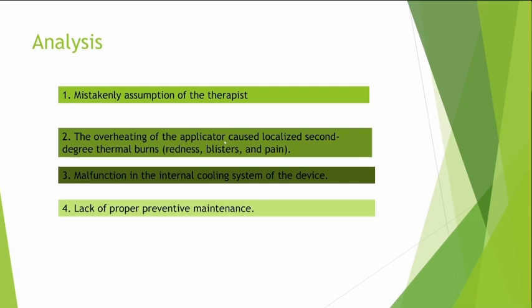The overheating of the applicator caused localized second degree burns, and the malfunction in the internal cooling system of the device is what caused it. The second degree thermal burns caused redness, blisters, and pain to the patient. And the last cause is lack of proper preventive maintenance.